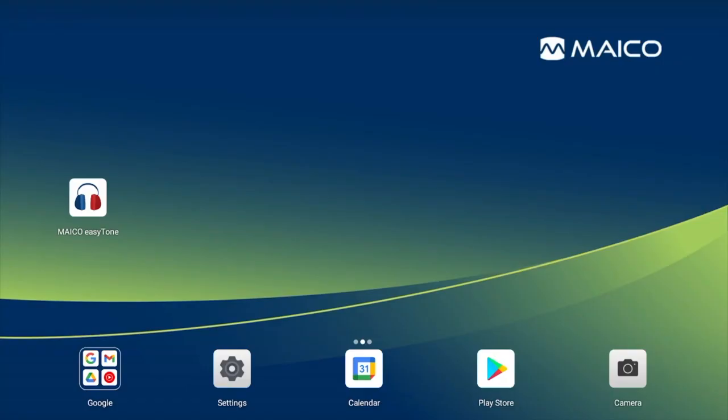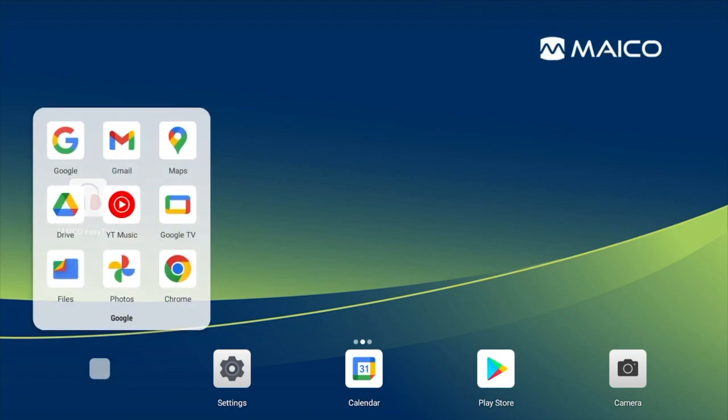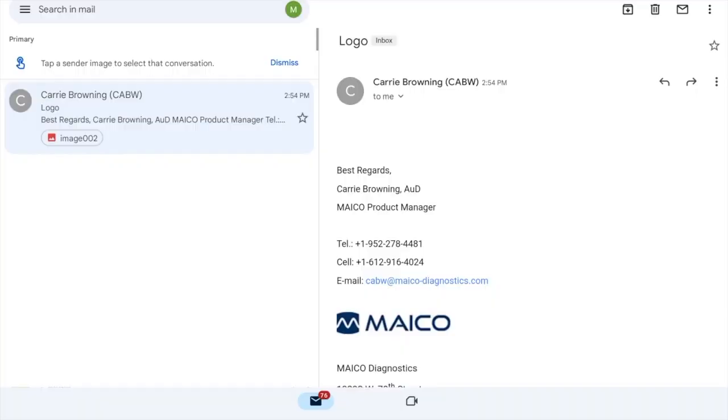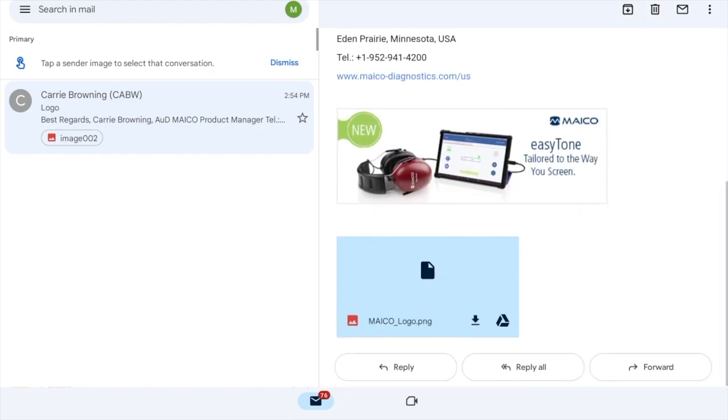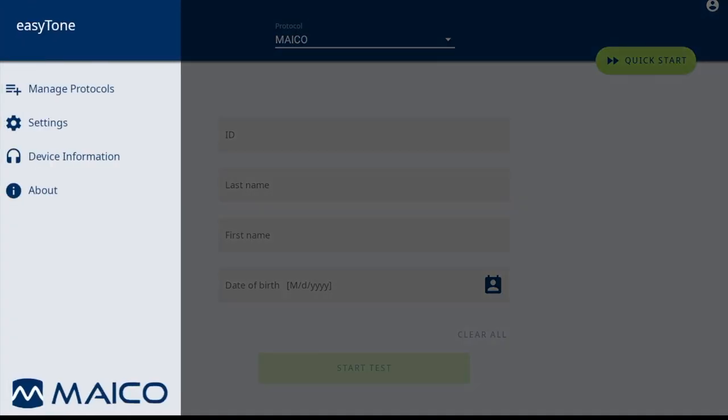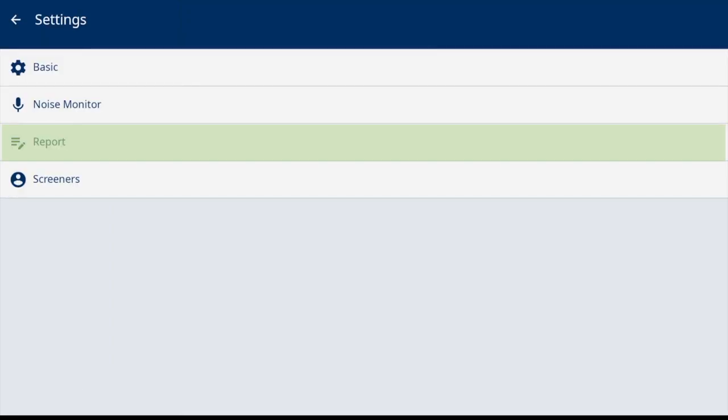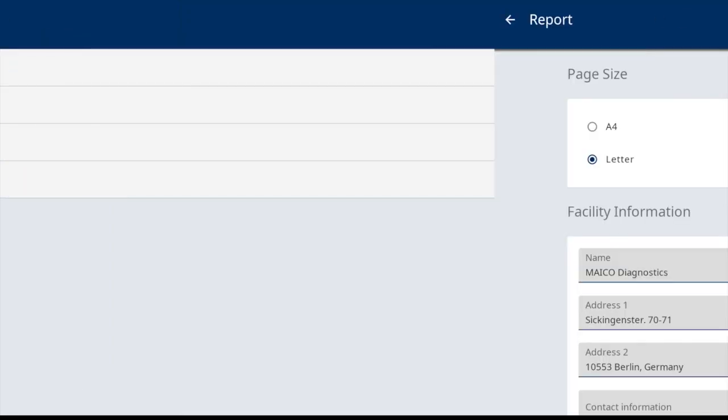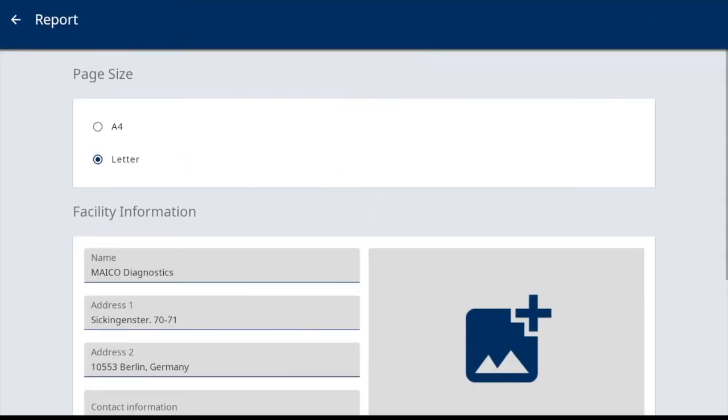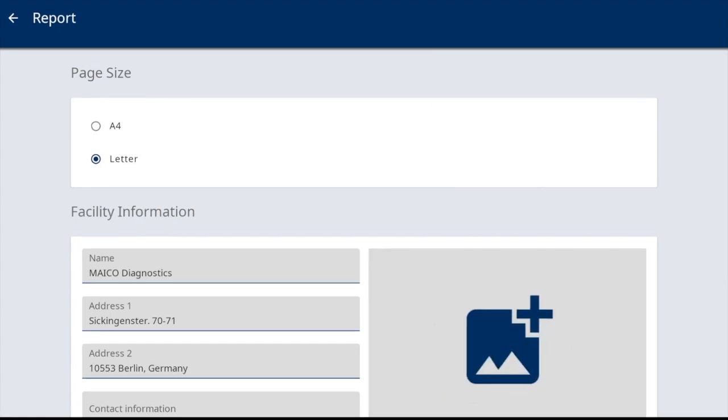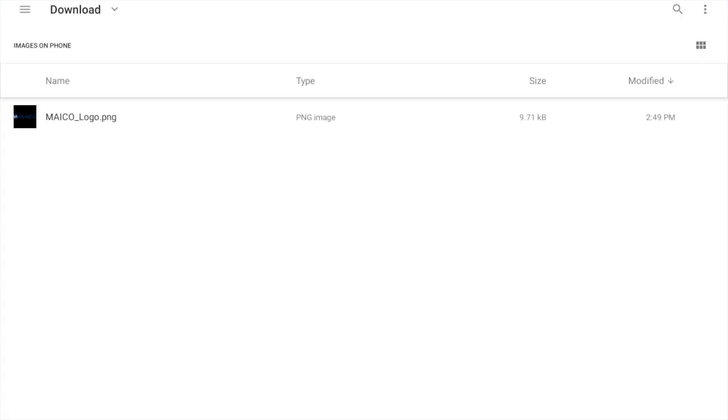Option one is to email the logo to the email account already set up on the tablet. Go to the email app to open the attachment, select the ellipse in the top right corner and select save. Go to the report settings and select the add image icon. This will take you to the download folder to select the logo file and import into the report settings.